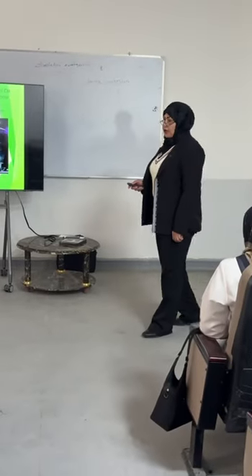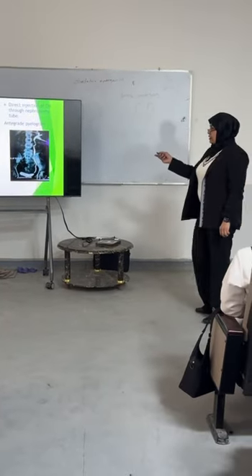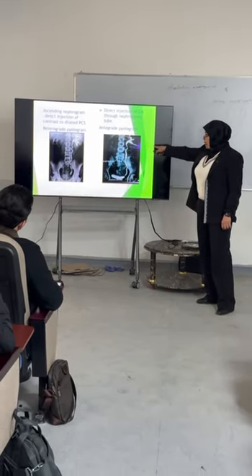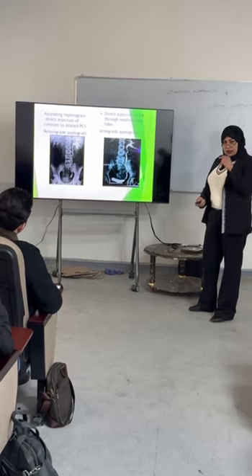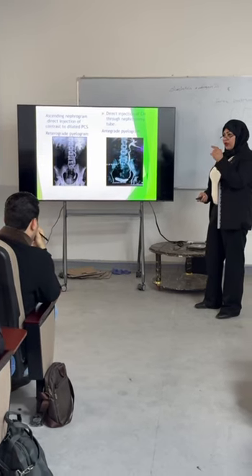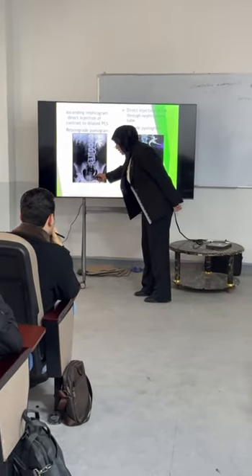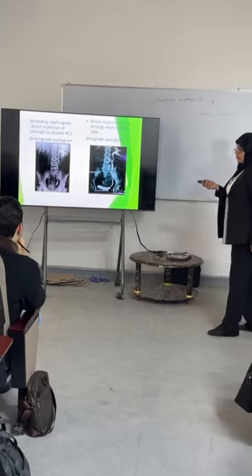This is the other type of contrast study. Antegrade pyelogram, which is direct injection of contrast media through the kidney by nephrostomy tube. The other is retrograde pyelogram, by passing the catheter through the urethra, past the lower sphincter, and then giving the dye.